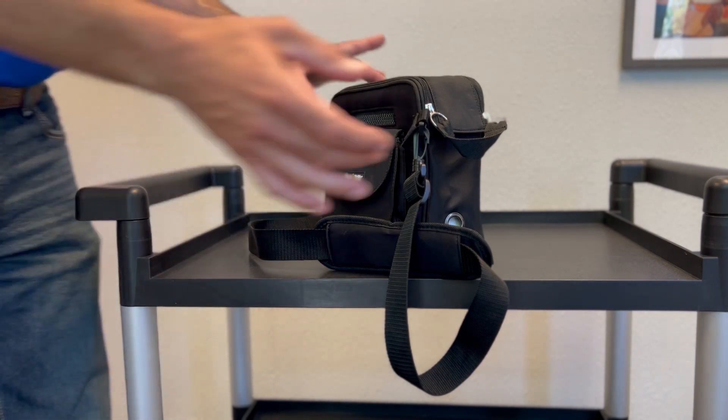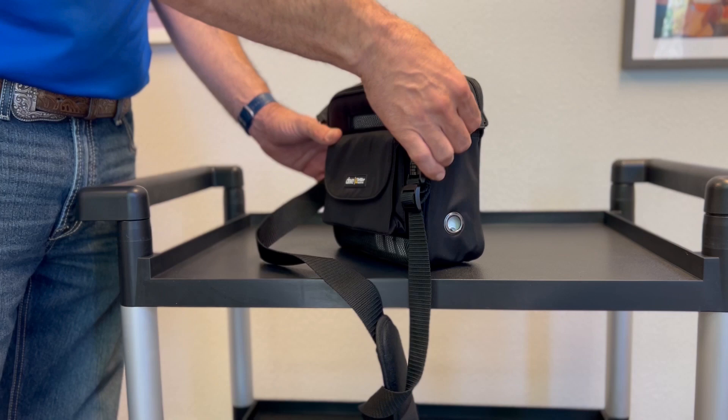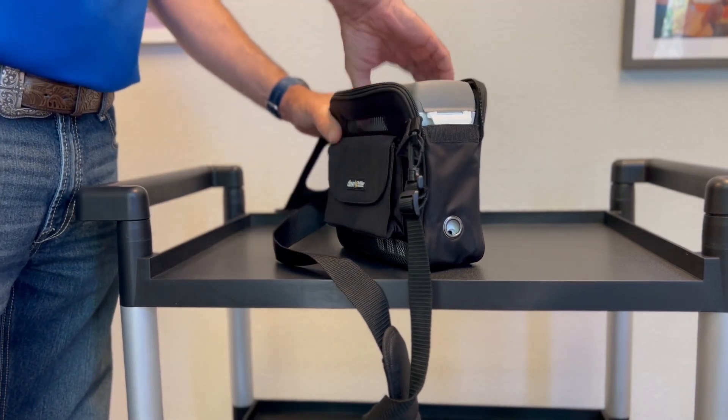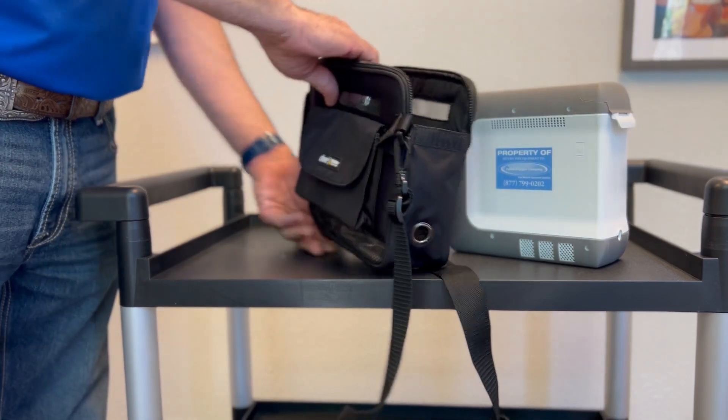To remove the carry case, grab the little strap, unzip it, pull that back, and pull the machine out.